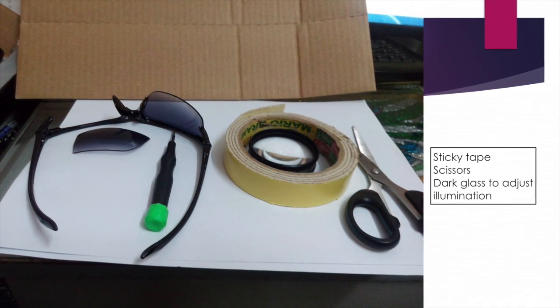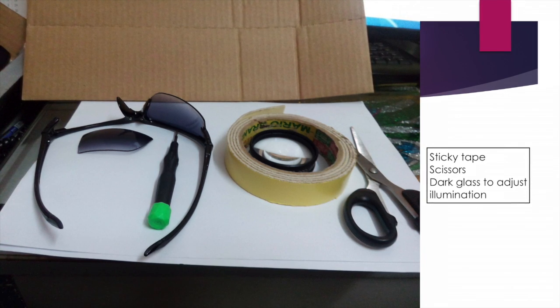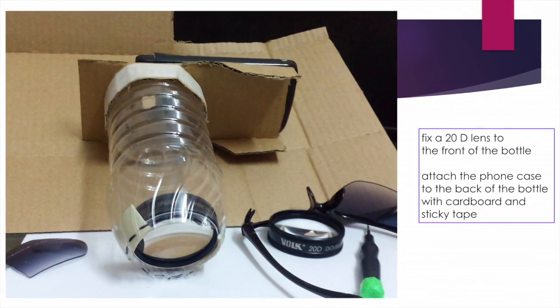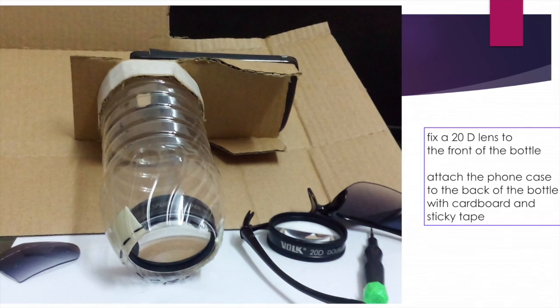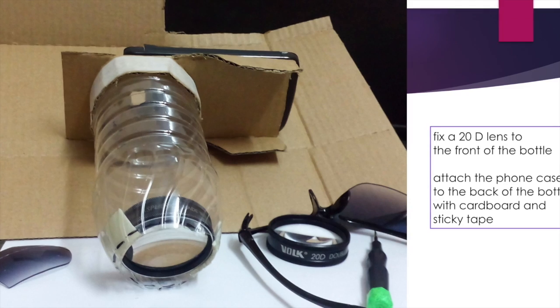In which case we will need a piece of sunglasses to reduce the illumination of the video light. Cut the narrow end of the water bottle and fix the plus 20D lens inside with some sticky tape.